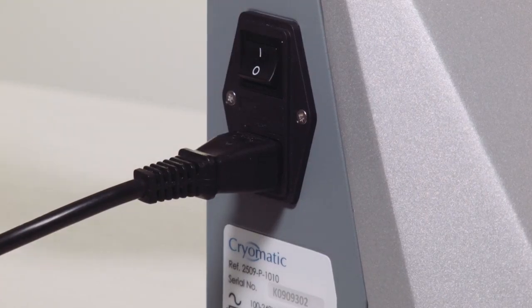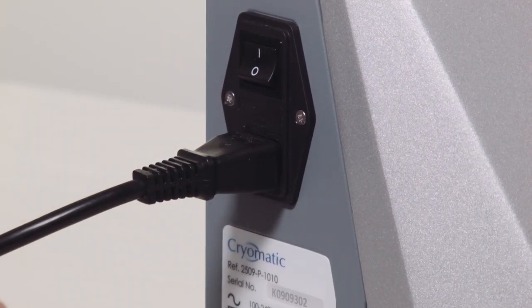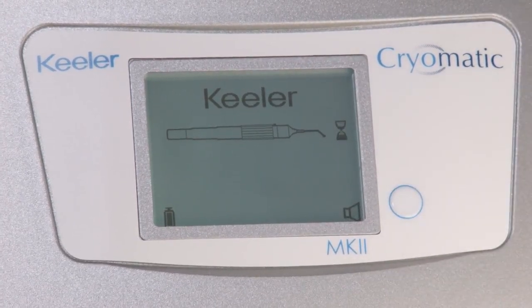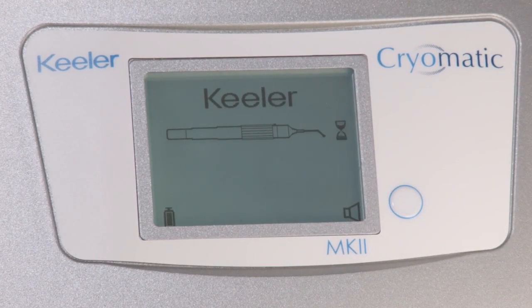After the initial setup, switch the cryo on using the mains inlet rocker switch. Initialization checks will automatically start and the cryo probe can be connected when they are completed.